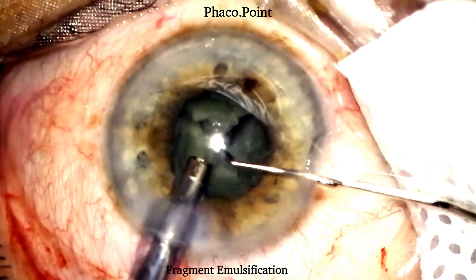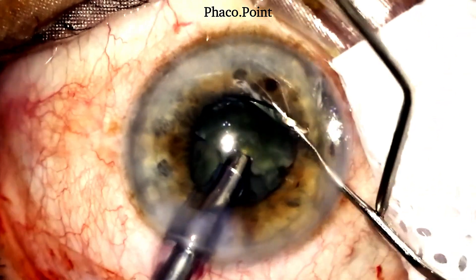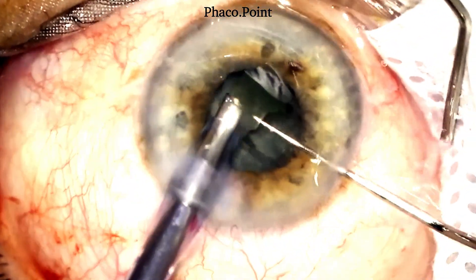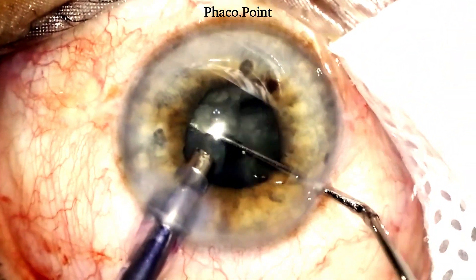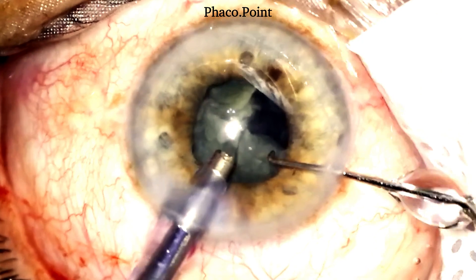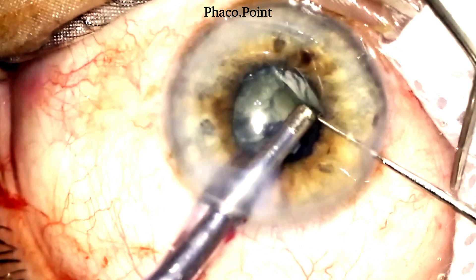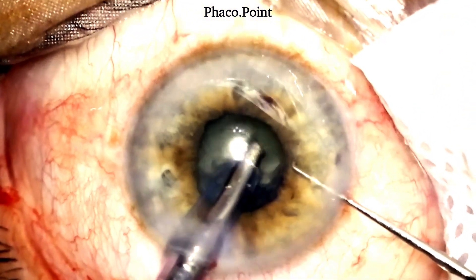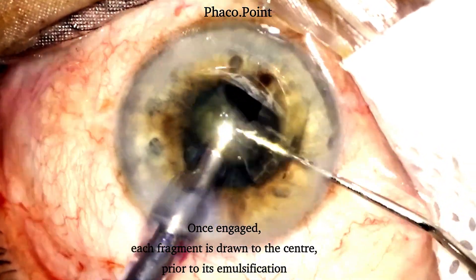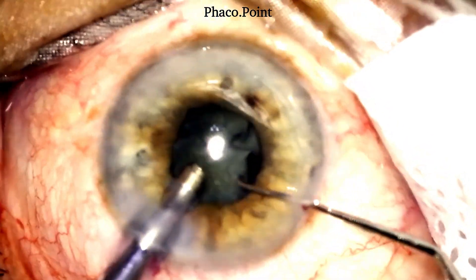Let's move to the emulsification of the individual fragments. Each fragment is rotated to lie directly opposite the tip prior to emulsification, after which each fragment is impaled by the phaco tip, drawn out into the pupillary plane — often partially into the anterior chamber — and if large, further downsized and emulsified. Note how each fragment is drawn right into the centre, the phaco probe held steady, and the fragment downsized and emulsified.